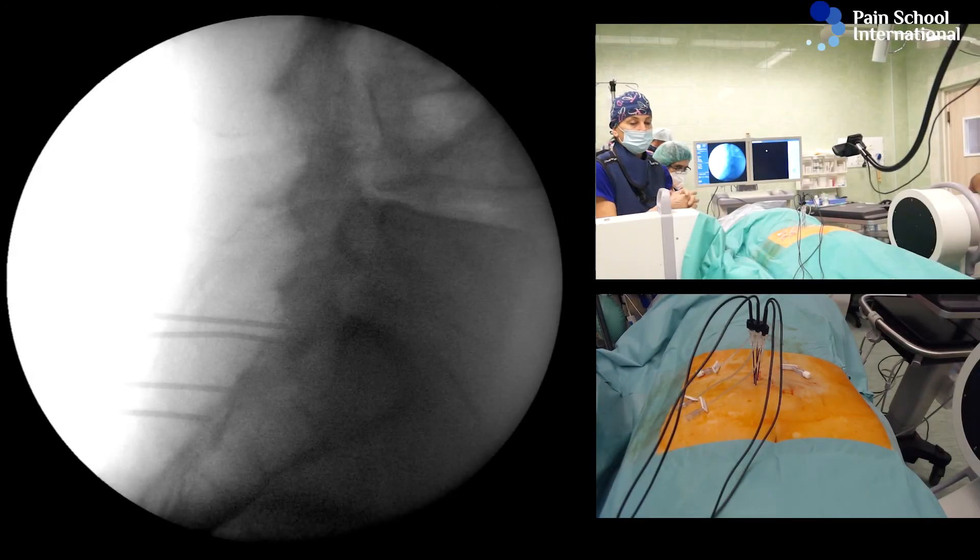Let's start stimulation. Motor — hit start — and we are stimulating the first two electrodes now.